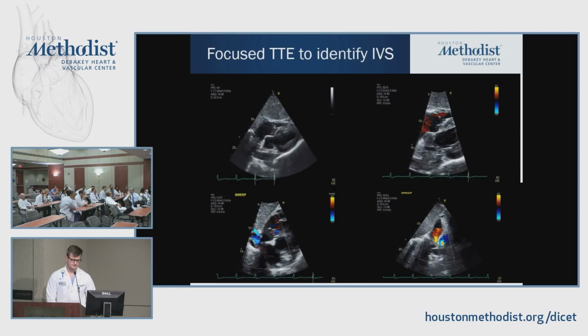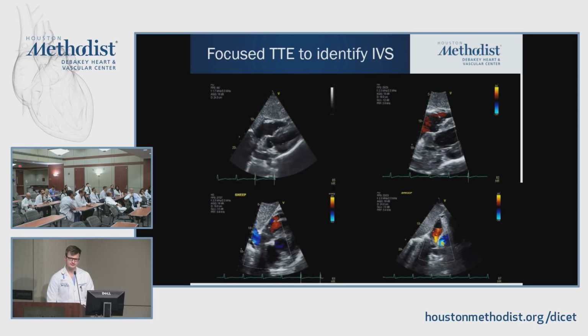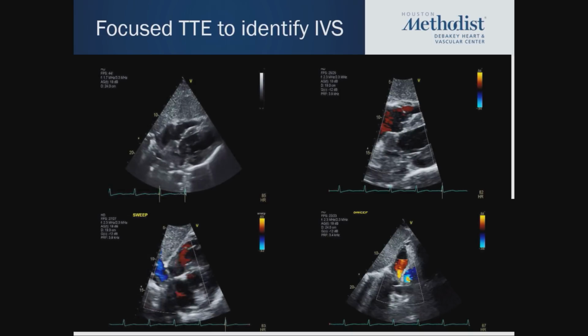Now, where it becomes impressive is if this ruptures. If it ruptures into the right atrium or the right ventricle, you're going to have physiology like a ventricular septal defect, with high velocity and everything that comes with it, a murmur and everything else. That's why you're not going to hear anything here. I also feel the location is maybe a little further down. I'm not sure, but I think most likely this is acquired, and we'll see what happens. The worst that can happen in this patient is that this ruptures. You'll hear a murmur, so as a clinician, when you listen to them every day, you're going to listen for a new murmur, and then you have to address it.